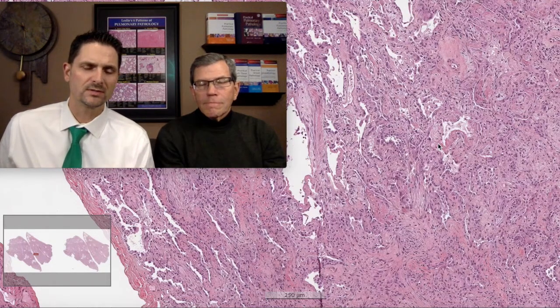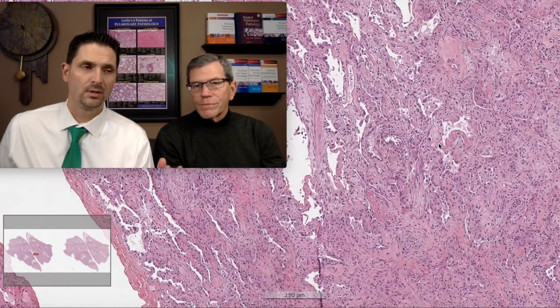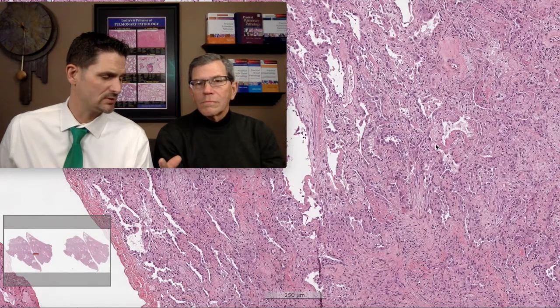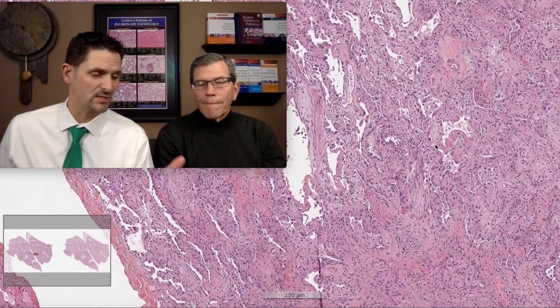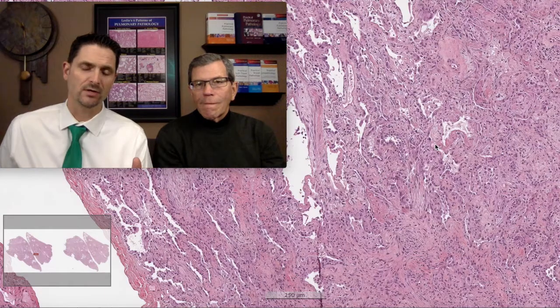D: drug reaction. What are the classic things you look for in the setting of a drug reaction, particularly amiodarone? Cellular changes — foamy cytoplasmic change in macrophages and type 2 pneumocytes. Classic features of drug reaction in the setting of acute lung injury.